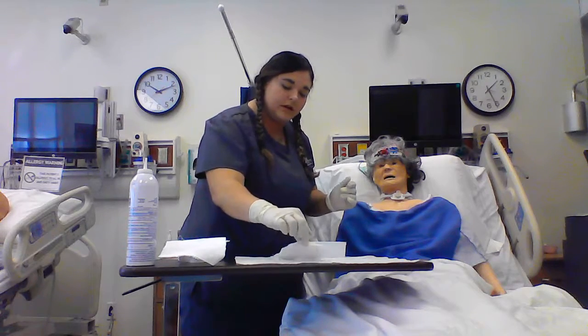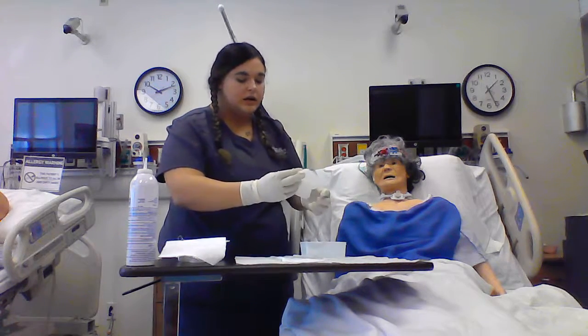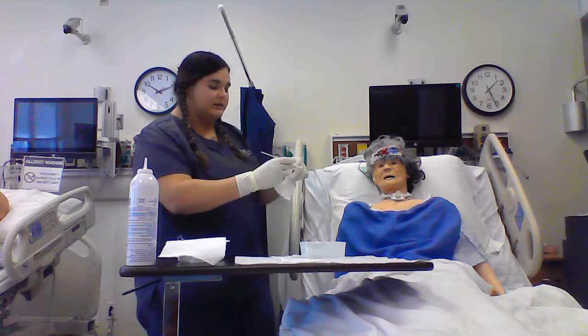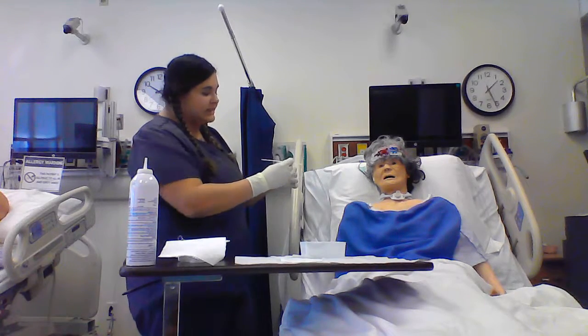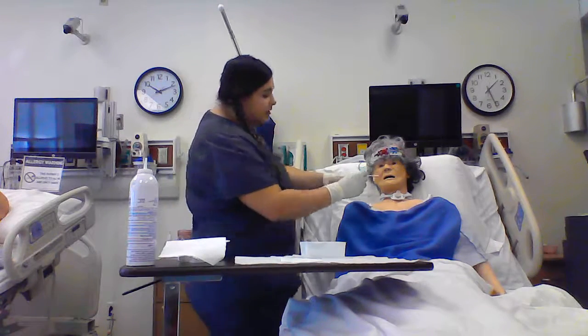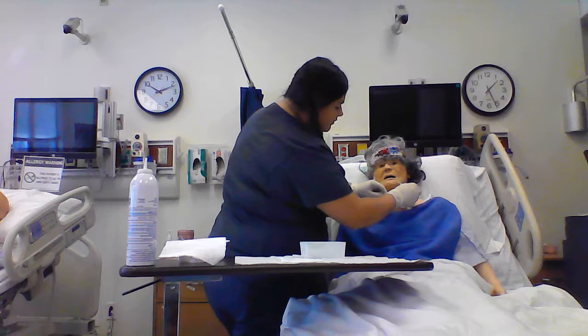I'm going to grab my V-sponge. I like to use Q-tips to help me place this under her trach ties and under the flanges because at this point you need to stay as sterile as you can. Place it. Okay.